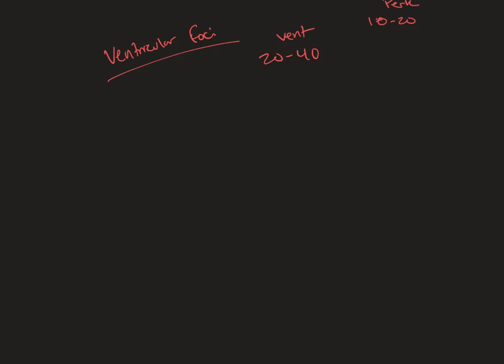They're going to be wide because they're just propagating from myocyte to myocyte, and that's when you get these wide, 120 plus QRSs. You're going to have no P wave because there is no supraventricular impulse. It's just blah, wide.